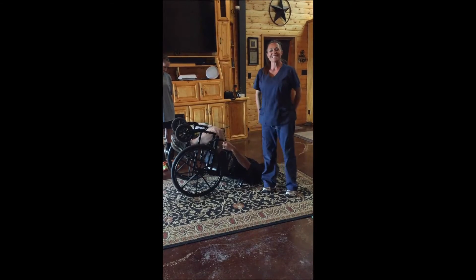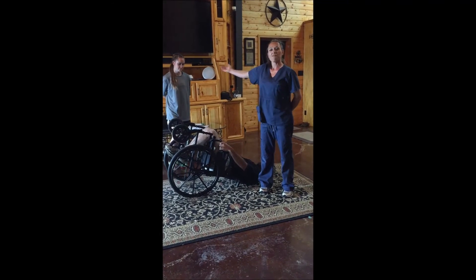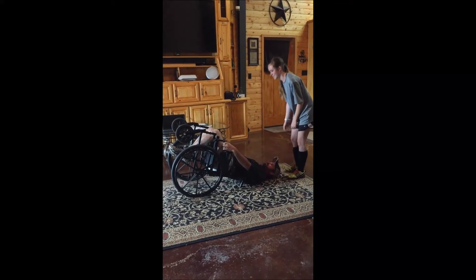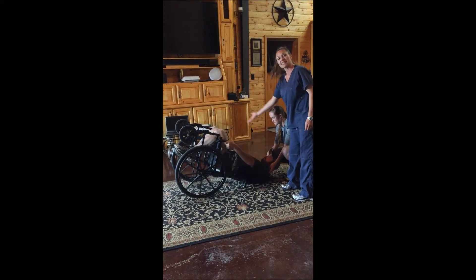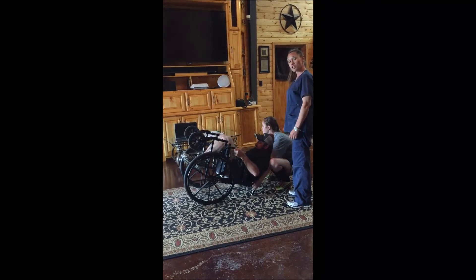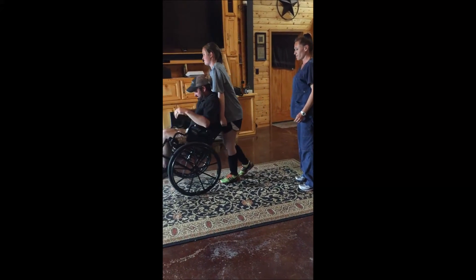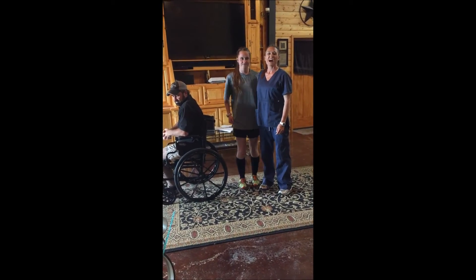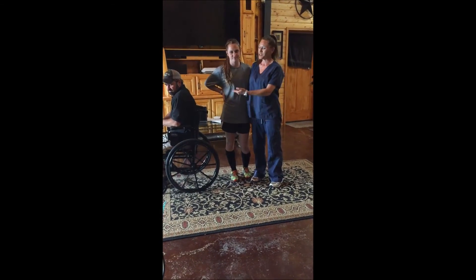Now, to show you how easy it is to use the wheelchair to lift someone off the floor, I'm going to have my 14-year-old lift him off the floor. Have her squat down, tell him to lean as far forward as he can. She's going to use her legs, keep her back straight, and raise him up. And that is how you get somebody off the floor who has not hurt themselves using a wheelchair.